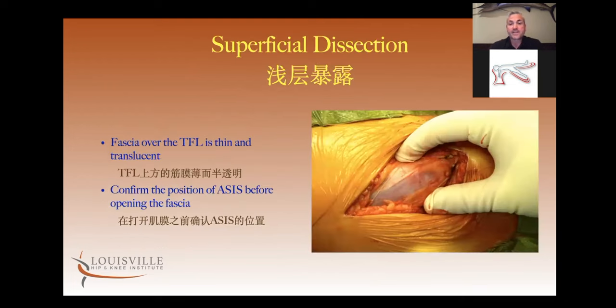For the superficial dissection, once we go through the skin, I again feel my ASIS under the skin before making the fascia incision. The fascia over the TFL is very thin, translucent, kind of blue. I'm not going to open it until I feel the ASIS again — I feel it before I cut my skin, and as soon as I get through the subcutaneous fat, I feel it again and make my fascia incision, knowing that that muscle belly is TFL and I'm in the correct surgical interval.